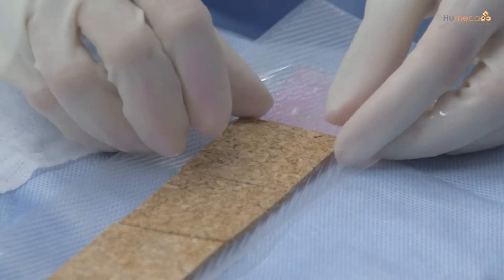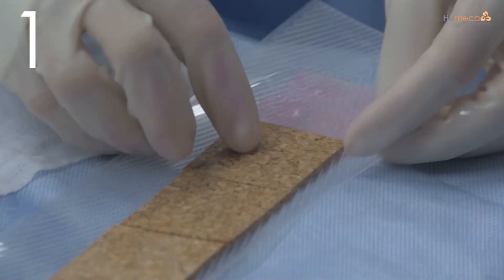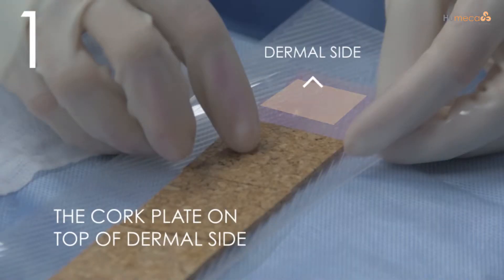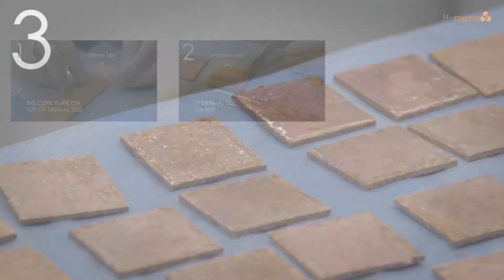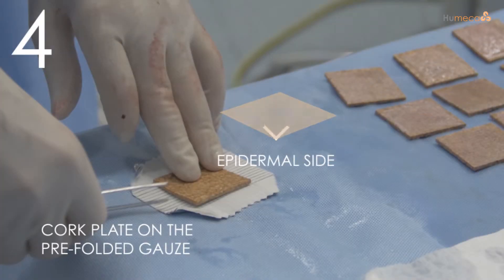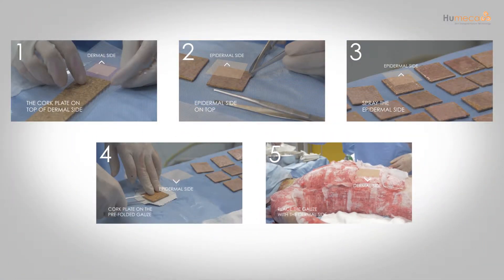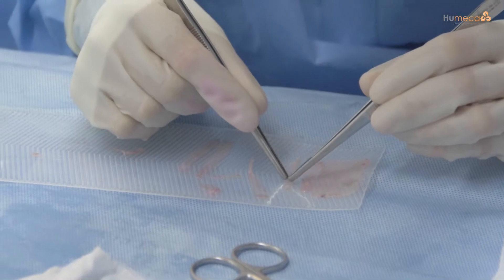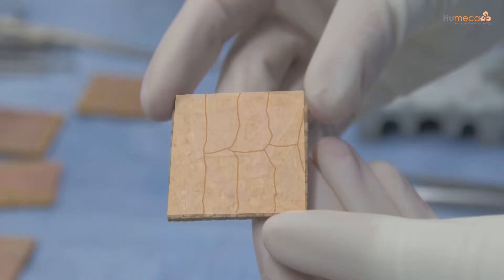Always make sure that the dermal side is against the cork, so that you will end up placing the skin islands dermal side down on the wound bed. Place the cork plate on the dermal side of the skin, then turn the cork plate over with the epidermal side on top. After cutting it twice, spray the epidermal side with glue. Then place the cork plate on the pre-folded gauze, taking care that it has lined up exactly on the central square of the gauze. After removing the cork plate and expansion, place the gauze with the dermal side of the skin on the wound bed. Leftover pieces of skin can also be used, so no skin is wasted — this is especially advantageous in case of extensive burns where donor sites are scarce.